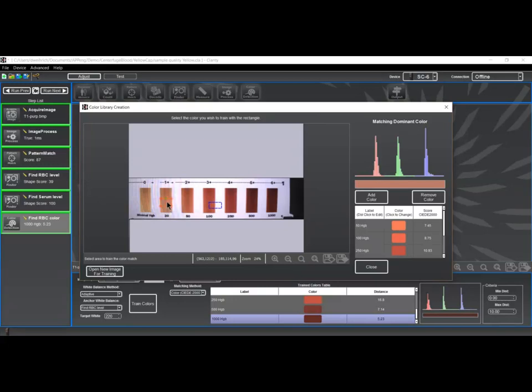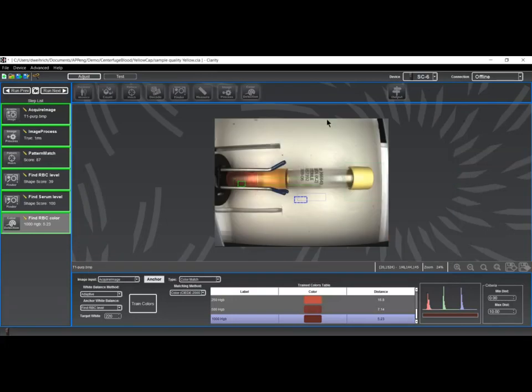For instance, I can grab a color off of one of these strips. I can add this color, give it a name that corresponds to its value in a table or an index, and save that color to this table. I've done this before with a different set of references. As you can see, you can add all these colors in. Now let's get back to the main script.